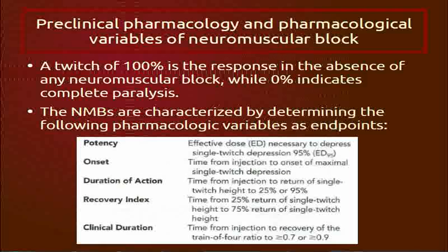How do we monitor our muscle relaxation? Train of 4. Who here has done it? Okay. And like most of you, I never did it before I got here. There are some terms that Stoelting and Miller like to use to define these twitches, and so we're going to use them as well.